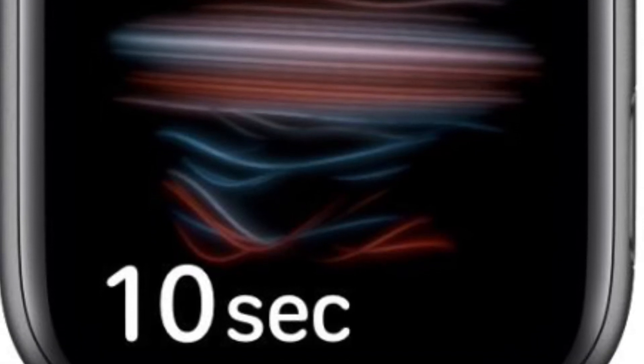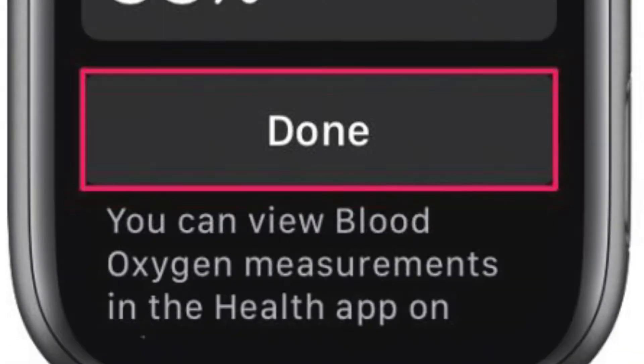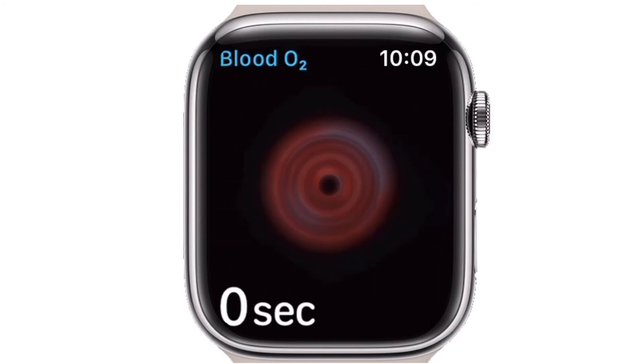Tap on Start and try not to move while keeping your Apple Watch facing up. Upon starting, you will get a 15-second countdown timer during which your blood oxygen levels will be measured. Keep your wrist still for the entire duration. Once complete, you should be able to see the percentage of oxygen in your blood. Tap to exit the app.